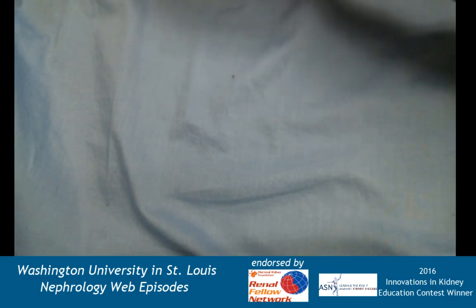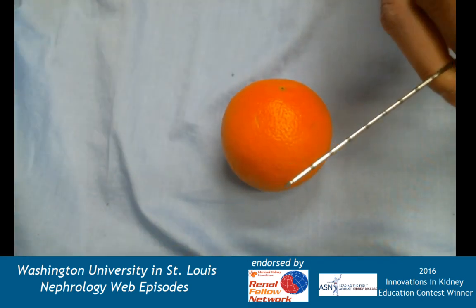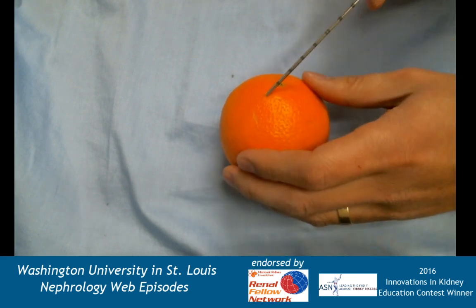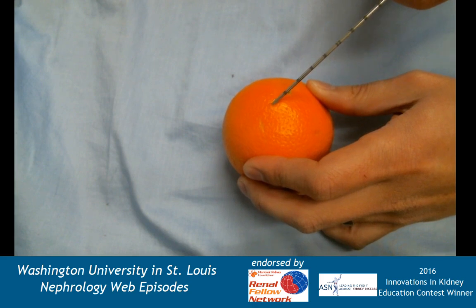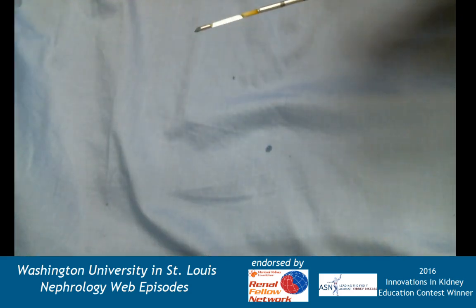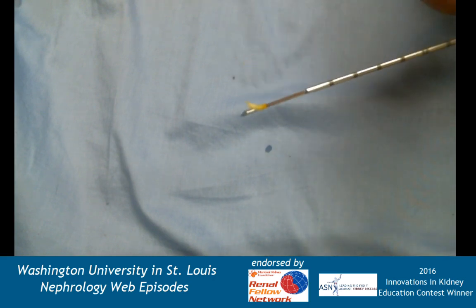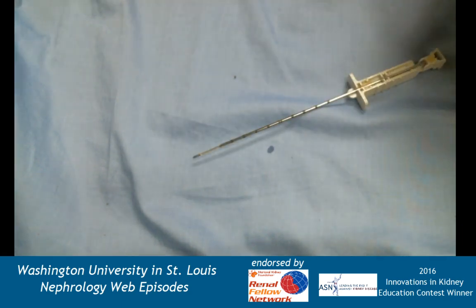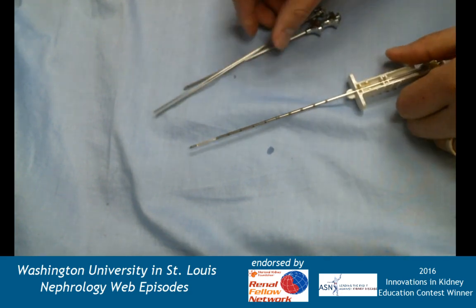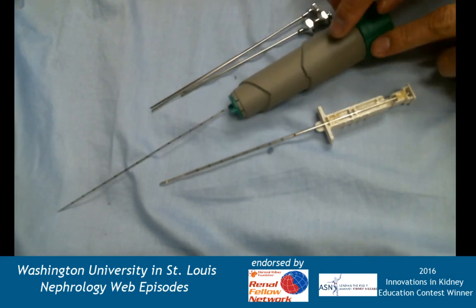Now with the manual needle: I pull the sheath back first, enter the kidney, push forward, and then pull back the outer sheath — you can see the piece of kidney inside. That's the hands-on demonstration of the kidney biopsy and how we've evolved from the Franklin modified Vim-Silverman needle of Kark and Murky, to the non-spring-loaded version, to now the modern kidney biopsy gun.